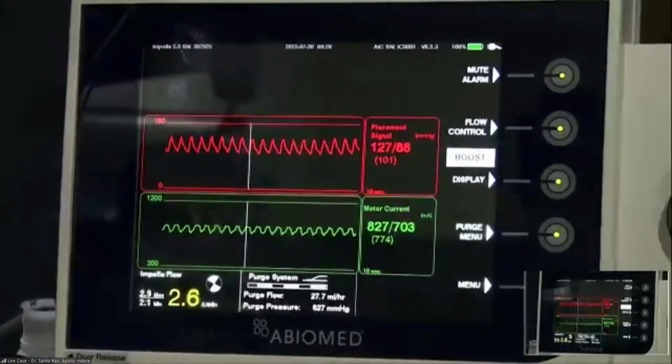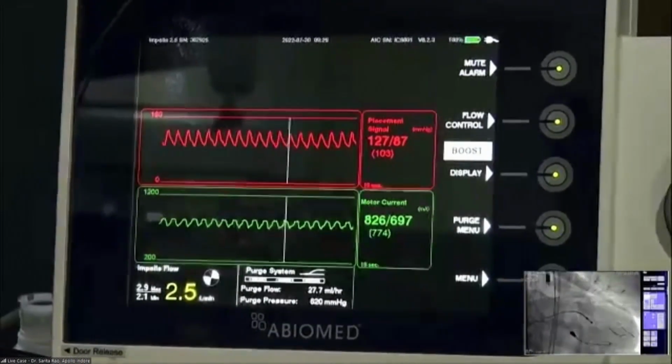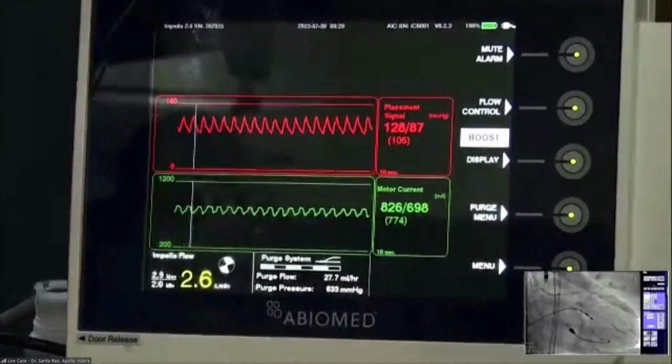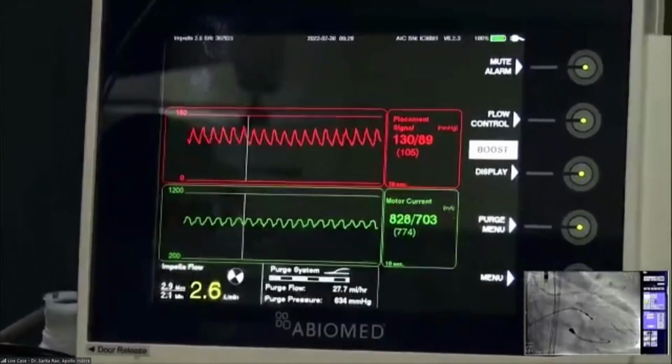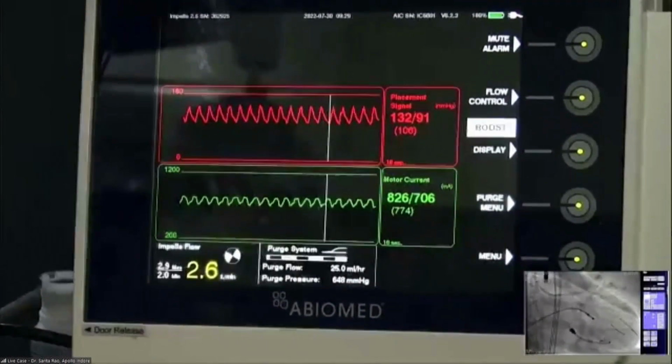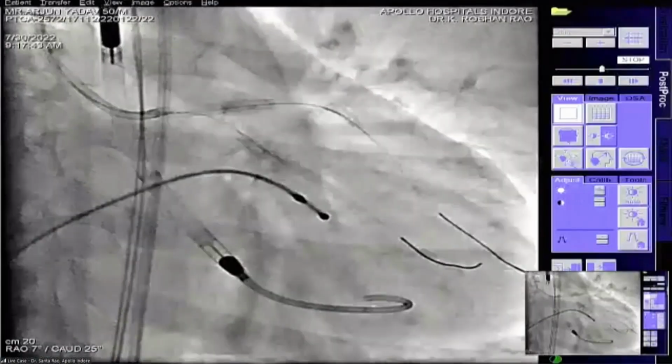Getting the stent back and a balloon back and inflating in the ostium to flare it up is also important. You should do it right away before you get the balloon out, because once you get it out, there could be some challenges in going in again. So it's better to do all the steps straight before you get the balloon out. I think now pressure is stabilized.